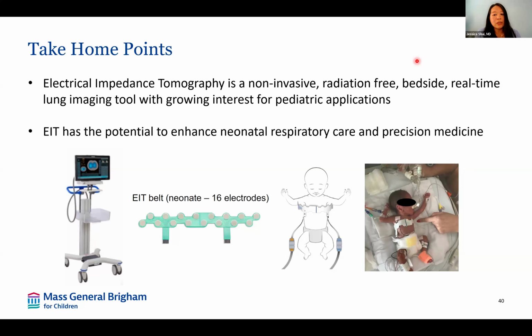But specifically for these cases, the BPD population, they were all corrected, like 43 to 48 weeks gestational age. So they used the pediatric size belt that was FDA approved. But for our smaller babies, like the RDS study looking at the CPAP modalities, yes, those we obtained parental consent for research. I think hopefully as time goes on, we'll have more FDA approval for some of these features.